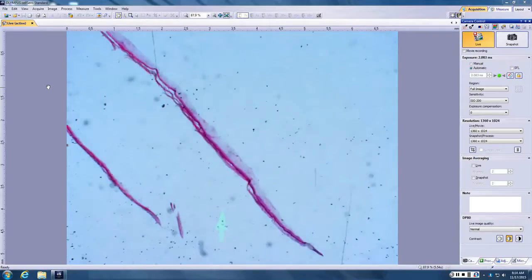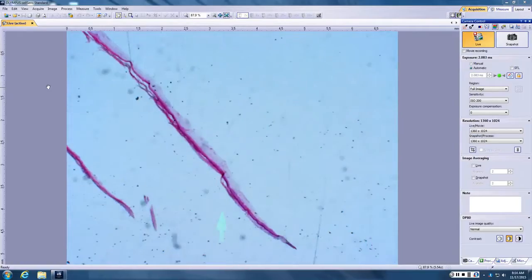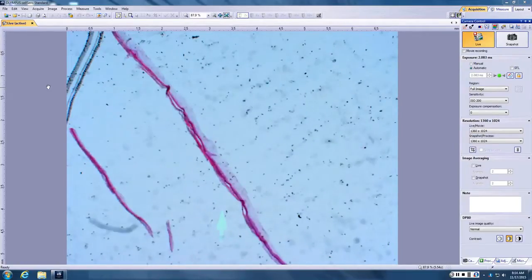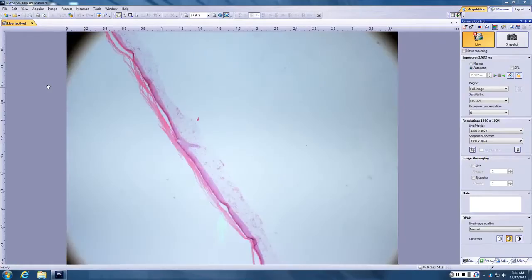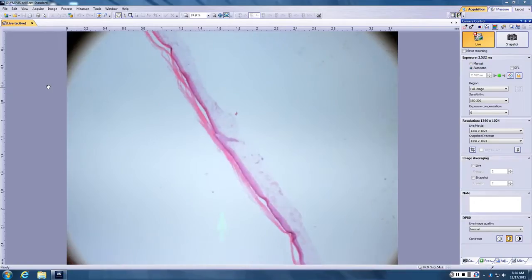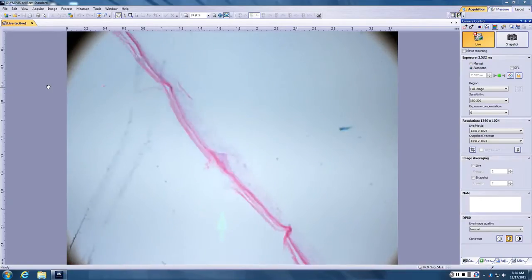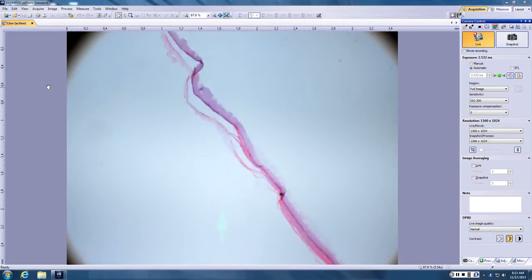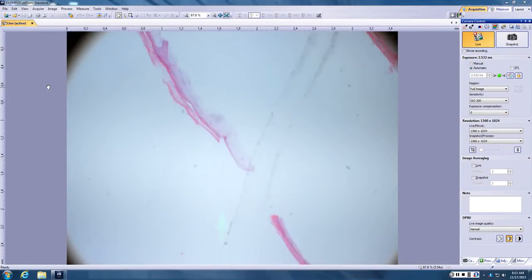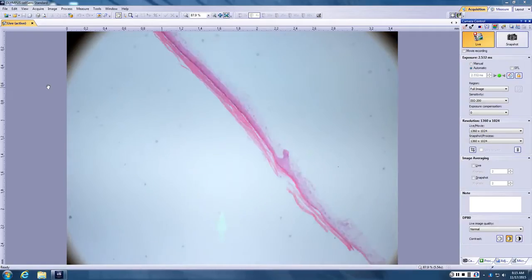Looks like a biopsy. Very small. Shaved biopsy, very atrophic epidermis. So a shaved biopsy, atrophic epidermis, very good. Looks like there's some beginnings of hair follicles, but it's hard to see that. Not much in the way of a lichenoid infiltrate, like you would think about for lichen sclerosus or radiation dermatitis with that type of atrophy. Okay, very good.